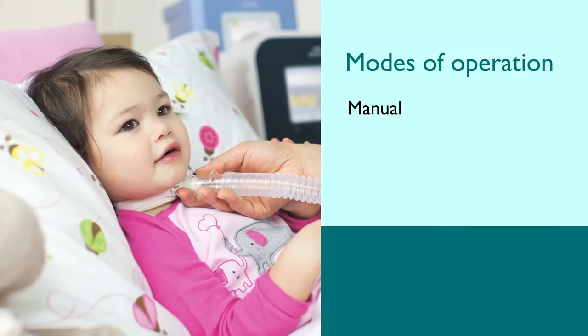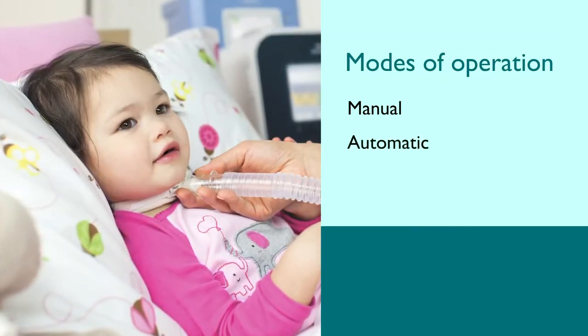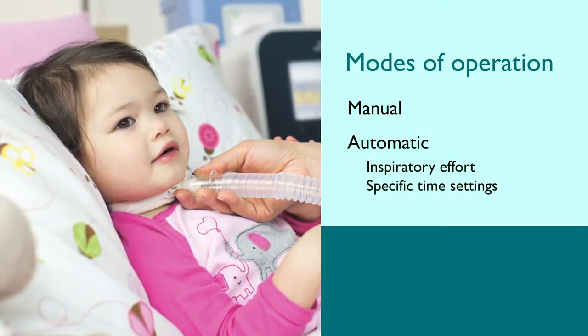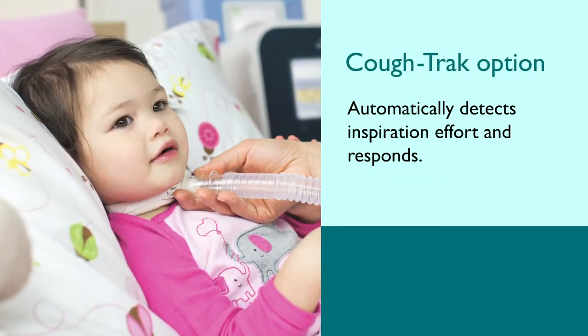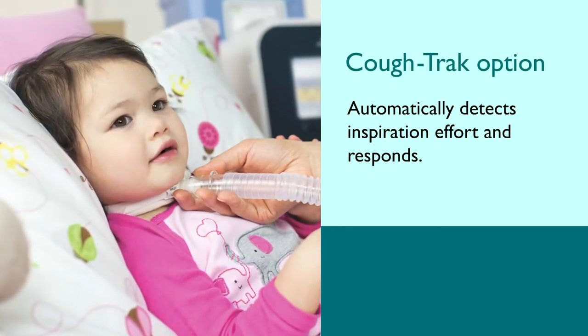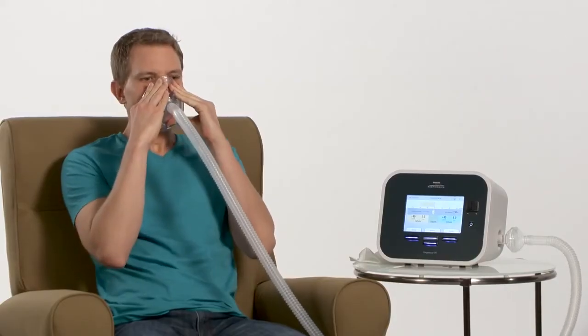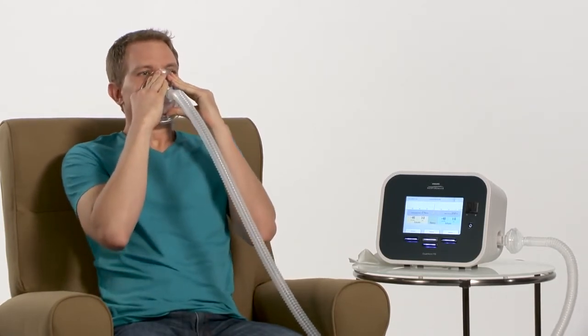CoughAssist E70 can be operated manually, which you have just seen demonstrated, or in automatic mode. In automatic mode, inhale, exhale, and pause times are controlled by the time settings entered. When using the cough track option, the device will automatically detect inspiration effort and respond with an inhalation. With automatic operation, there is no need to toggle the manual switch between inspiration, exhalation, and pause.